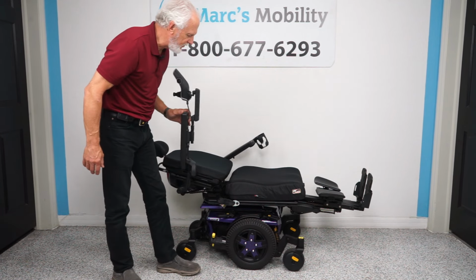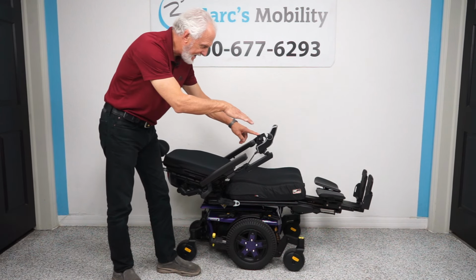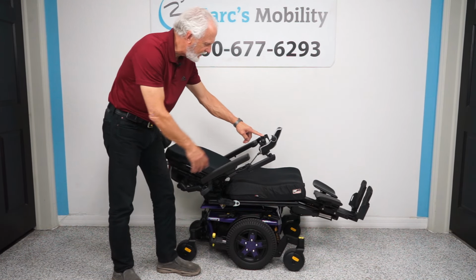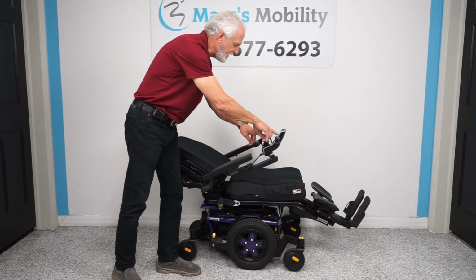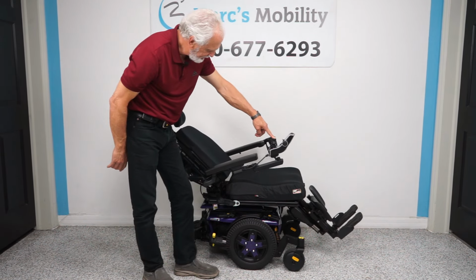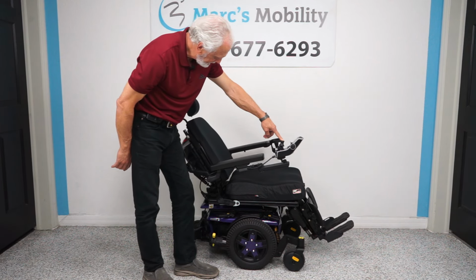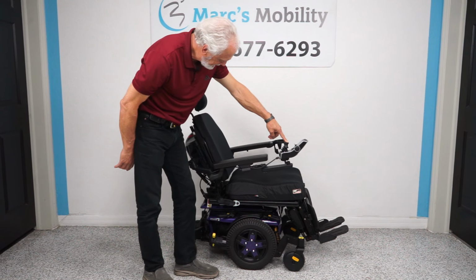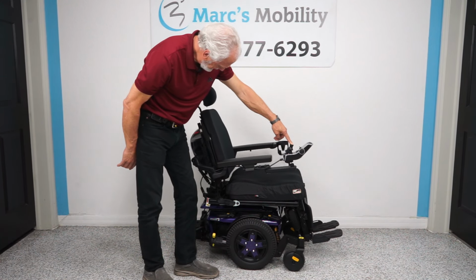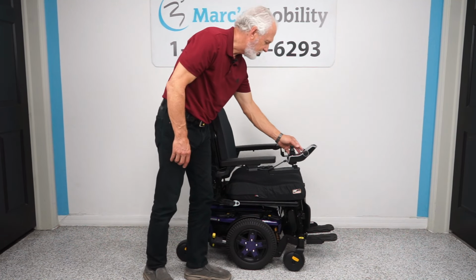As you can see, the arms do fold up. So what I'm going to do now is I'm going to bring the legs down and the back up at the same time. You can do the legs yellow and the back yellow and push the joystick forward, and you can have both of them come down and up at the same time. Okay, so now we're going to put it back in drive.